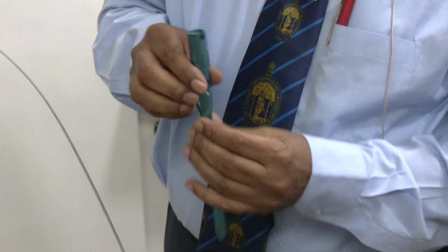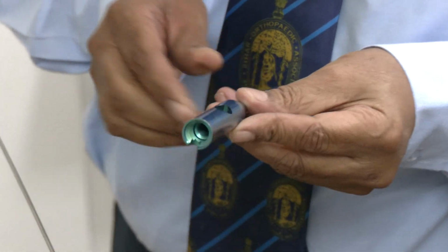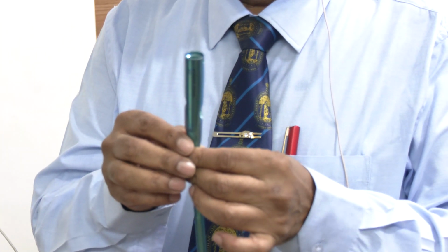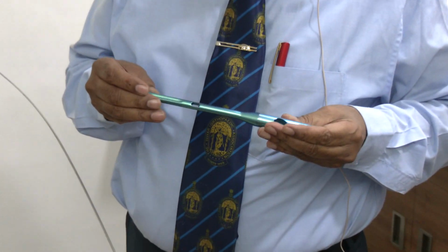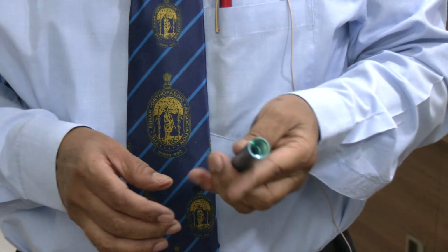Its shape has been slightly modified. This is also slightly rhomboid in shape. It is flatter in size and has about 6 degrees of mediolateral bend. This is the nail which we are using, the 9 millimeter demonstration nail.